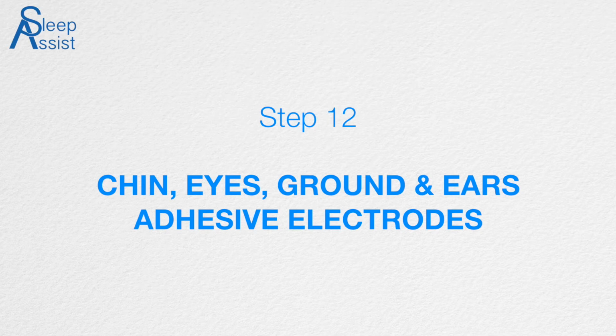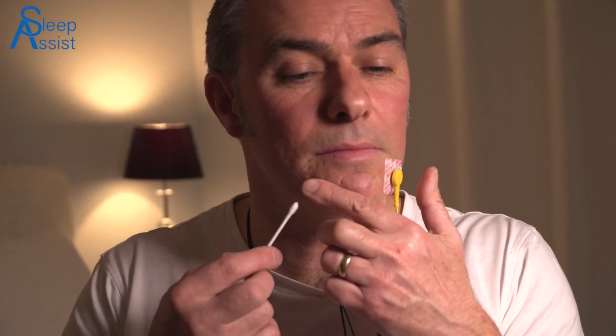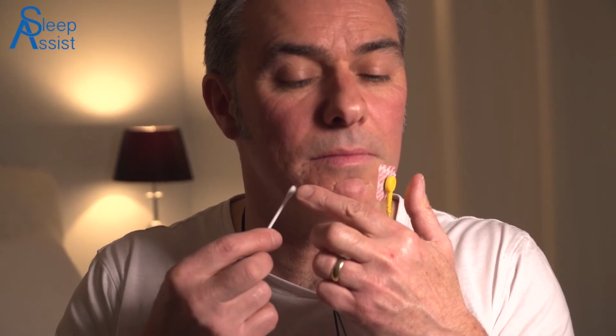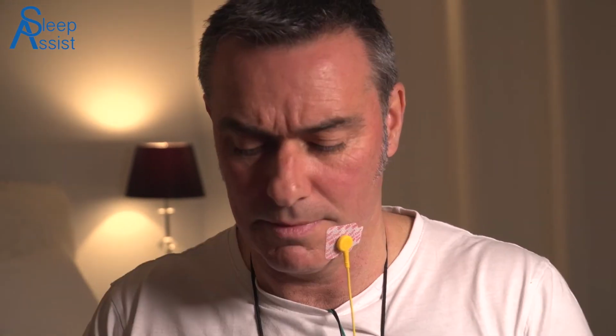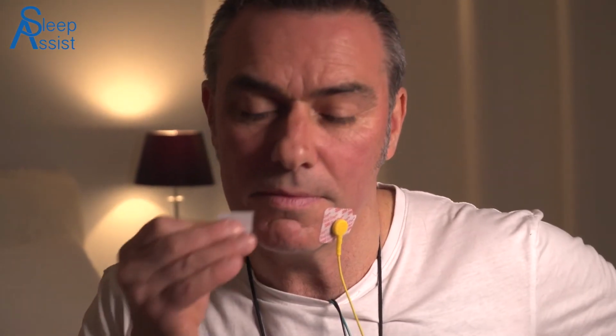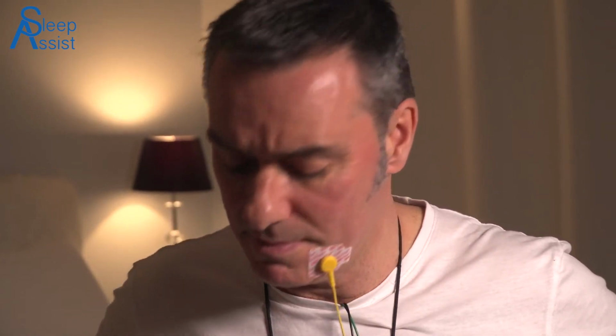Step 12. Chin, eyes, ground and ears adhesive electrodes. Using a cotton bud dipped in Nuprep, clean a patch of skin on the right side of your chin the size of a 50-cent piece, rubbing with a cotton bud for 20 seconds. With a fresh alcohol swab, wipe the area clean with one swipe only. Alcohol swabs must only be used once and then discarded.